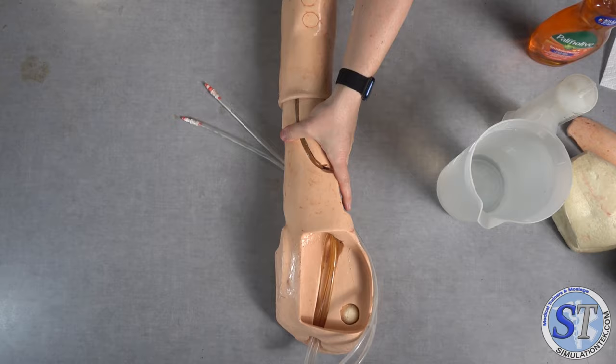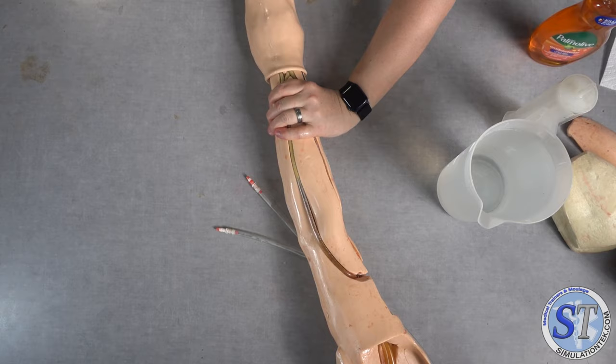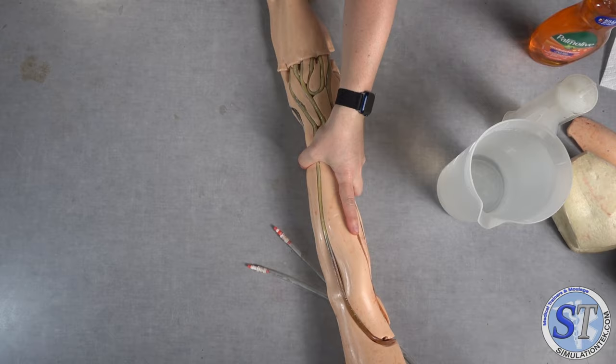And if you look, and you're lucky, everything should peel off. But again, that wrist is the hardest, so it takes a little bit of effort. With a little luck, it peels right off. So I know a lot of people are saying, well, why not just cut it off? That's an option. You really totally can cut these off. I'm just frugal. I like to use my things as test skins. I like to use them over and over again. I might need to fill this with some silicone or foam and do things with it. I'm just a pack rat, so I tend to keep things.